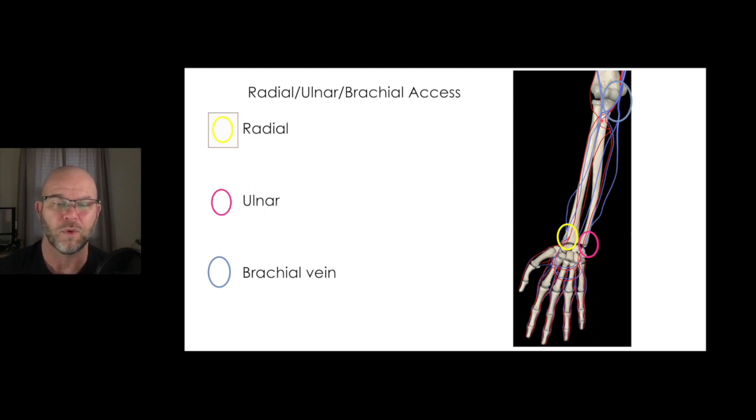I say there's more stimulation when you go radial or ulnar because of the medicines that are given through there to prevent spasm. One of the things that can stop you from going through the radial artery is that when you get in there, there's a lot of spasm, and they can lock down on that catheter. Usually the patients don't remember that much because they've had Versed or fentanyl and other things, but there are different tricks to loosen that up and break that spasm. Most places give a heparin, a nitro, and a verapamil cocktail. I'm sure there are several other places that do different things.